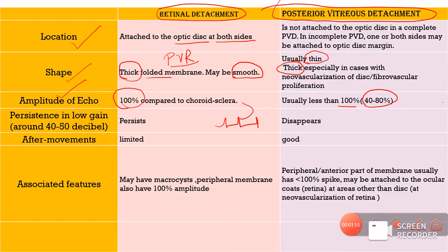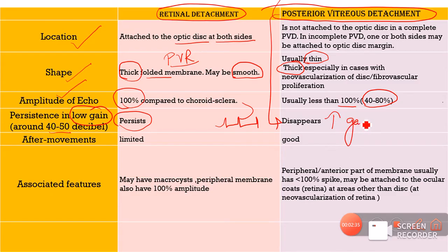As I discussed in my basic video on B-scans about the gain setting, in case of a posterior vitreous detachment, we have to increase the gain in order to make out the PVD. When we put the setting to a low gain of about 40 to 50 decibels — decreasing the brightness of the B-scan — an RD, which has more reflectivity, will still persist on the B-scan. However, a posterior vitreous detachment will actually disappear. So in order to see a PVD, we need to increase the gain; whenever the gain is decreased, the PVD will disappear.